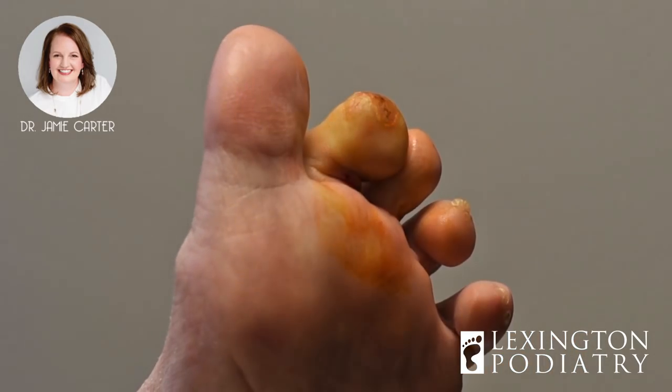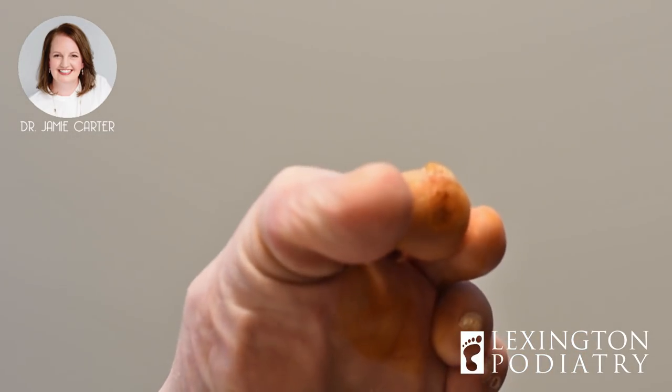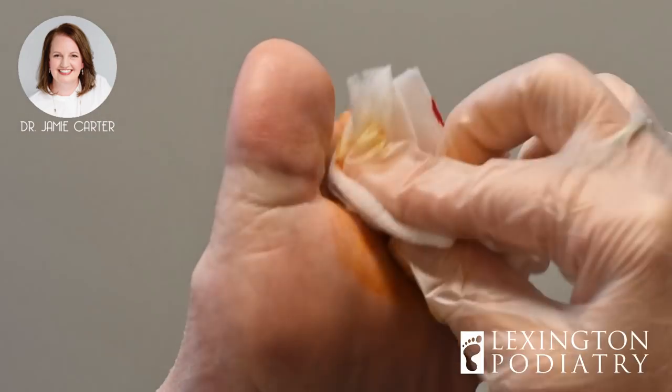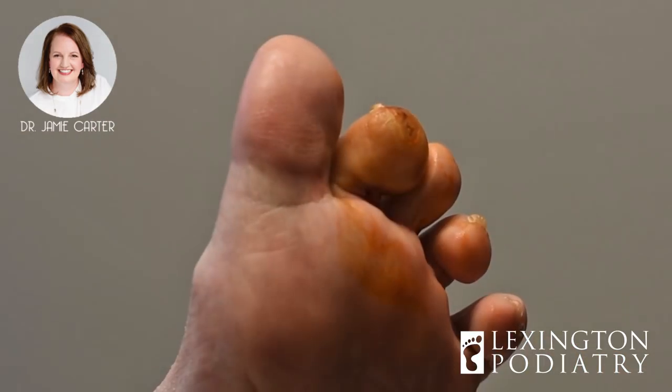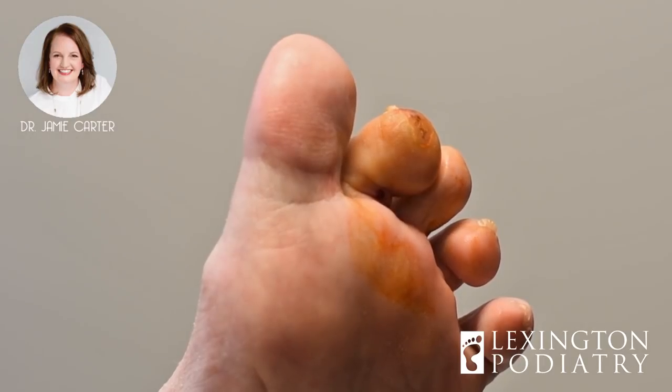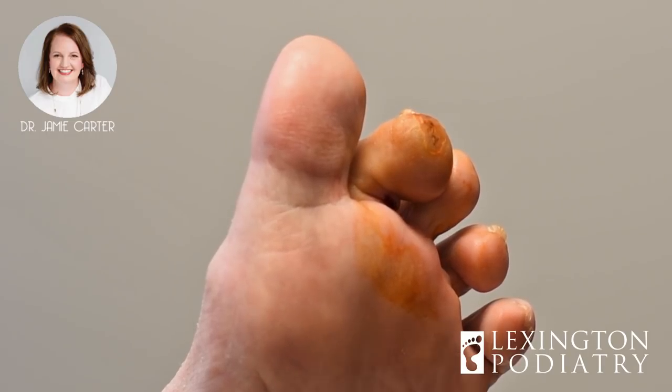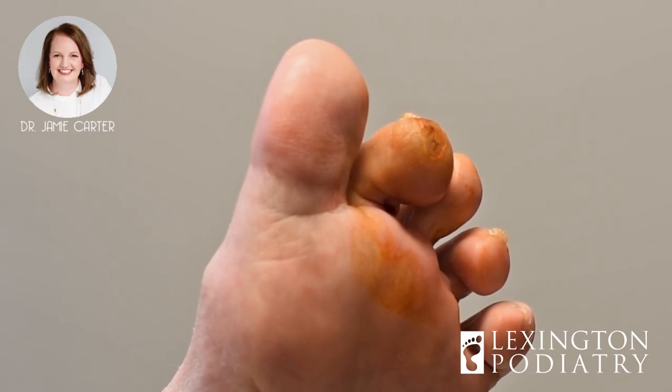All right, bend them one more time for me — perfect. Okay my dear, let's get you wrapped up. The first thing I do is wring it out really good, and I'm going to splint it.